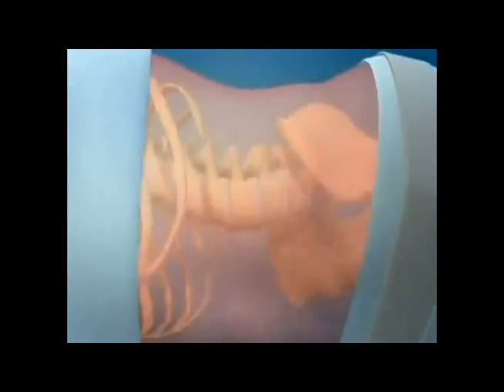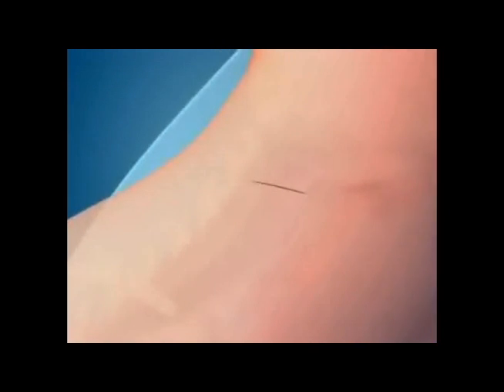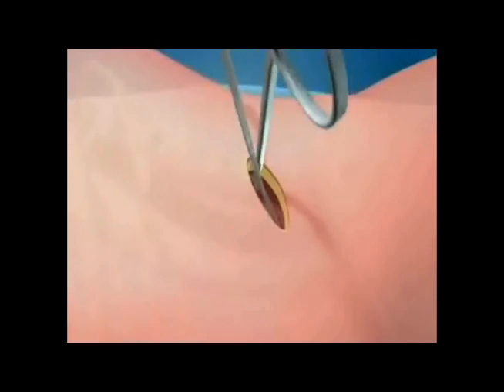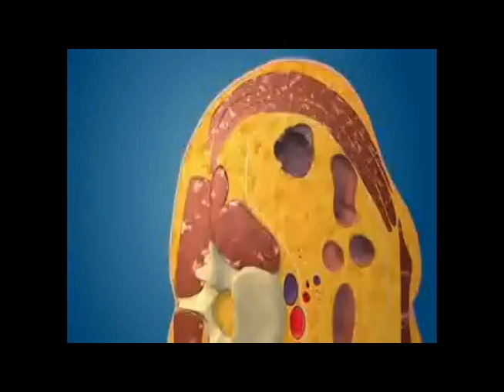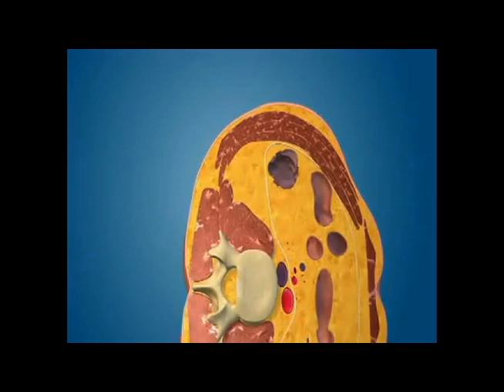This is an animated depiction of the direct lateral interbody fusion. The incision is made on the side just above the pelvis. A small incision is made and the tissue is opened without cutting any muscle. The spine is accessed behind the abdominal contents, which are retracted out of the way for the approach.